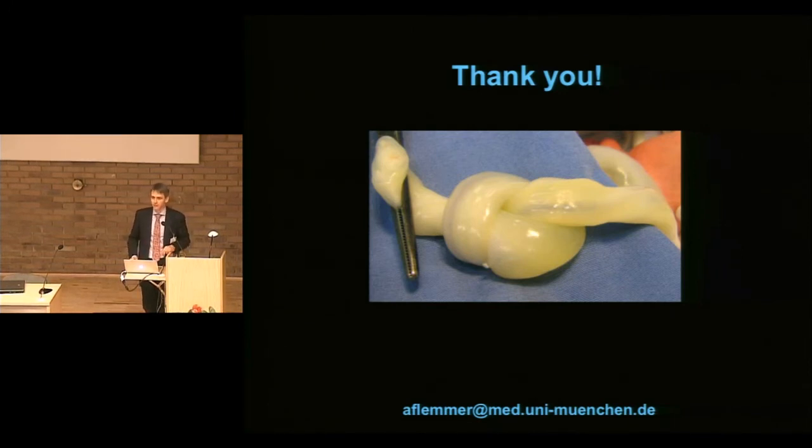That's a very interesting question. There is one study looking into the success rate of umbilical venous catheters in one unit. I think it was in France, where they had a success rate between 50 and 70%. There are some tricks aside from compressing the liver: using a second catheter in parallel with the one that is malpositioned, because you usually feel it quite well, then just move another one alongside this one in place. That sometimes works because you're already occluding the false way, but then you have to have quite a large lumen of an umbilical vein.